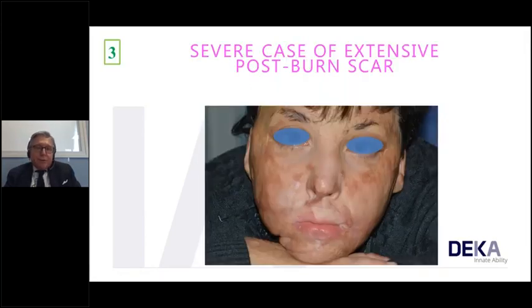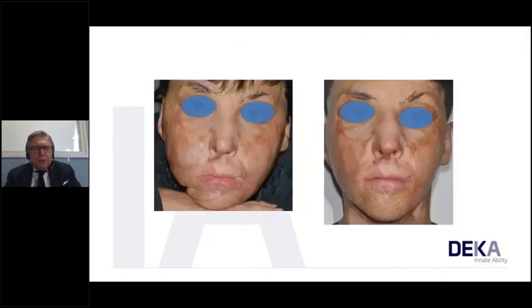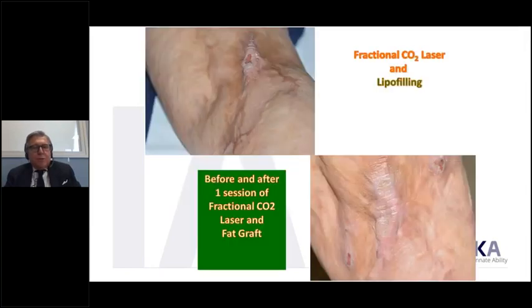Another case, very interesting and significant, a severe case of extensive post-burn scar that we treated with fractional CO2. We restored not only the flexibility of the skin, which at the very beginning was very hard, but even the oval and the appearance were improved. We even used fractional plus lipofilling, another procedure that we adopt in this kind of clinical case of post-burn scars.